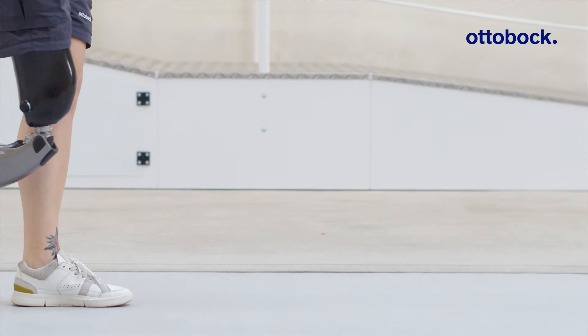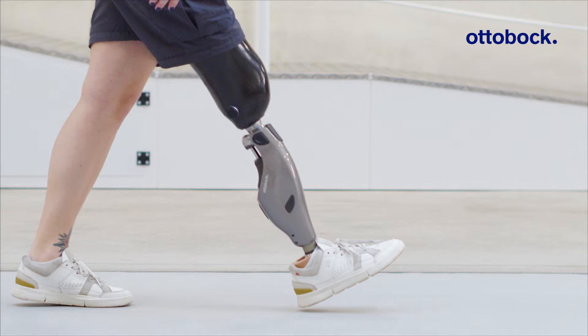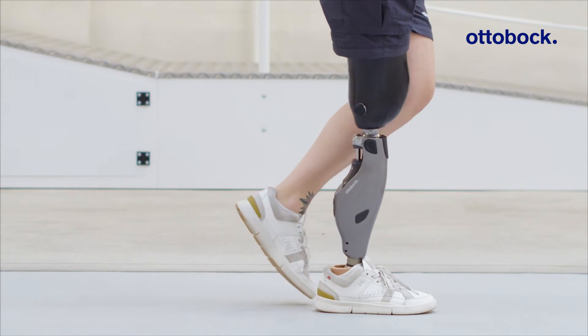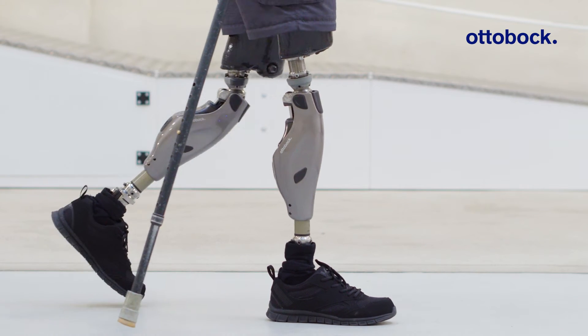When the pre-flex function is on, the knee joint is flexed slightly at heel strike. This encourages walking with stance flexion and leads to a more natural gait. Further benefits are the increased shock absorption during heel strike and a more energy-efficient gait pattern.